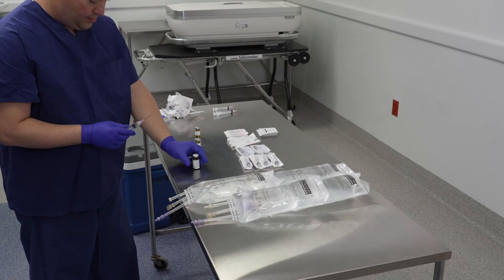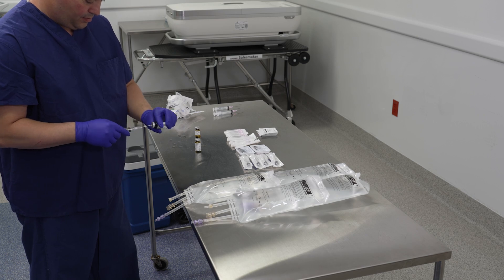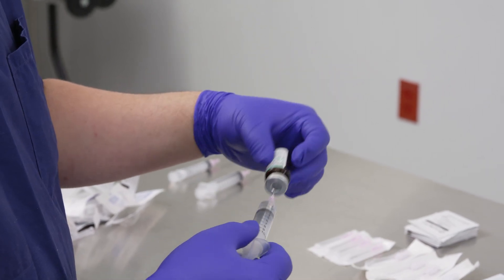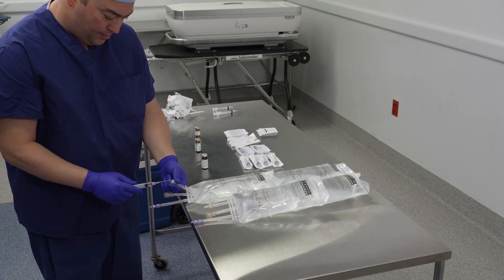Based on an example concentration of five milligrams per milliliter, use a sterile syringe to draw up two milliliters of nitroglycerin and inject it into the vasosol.